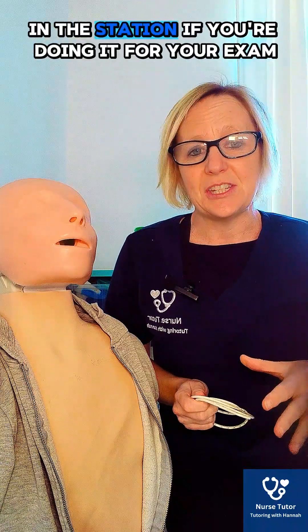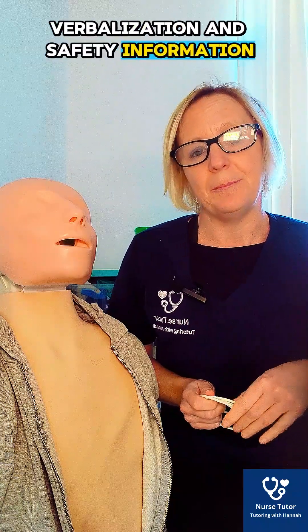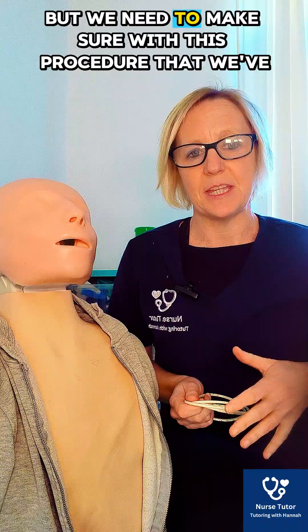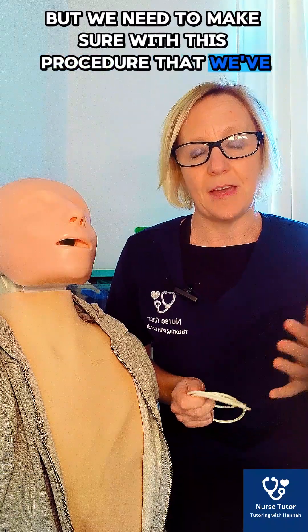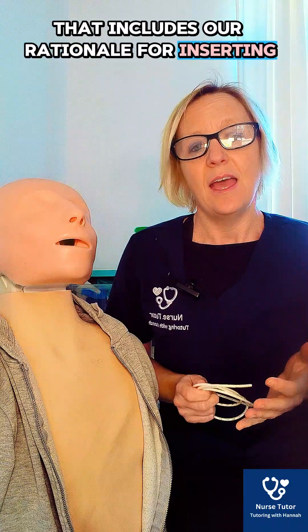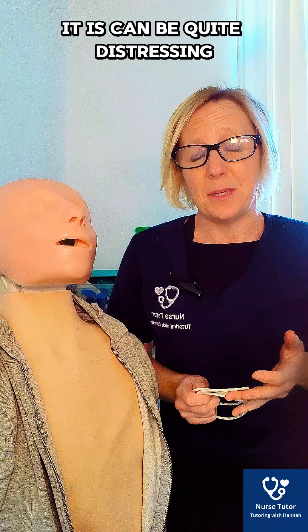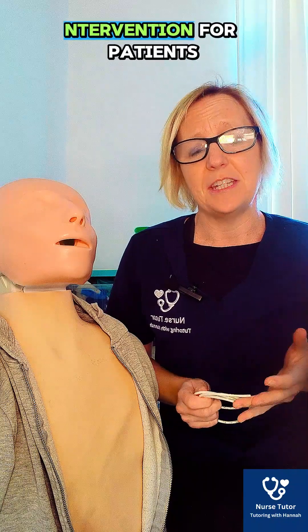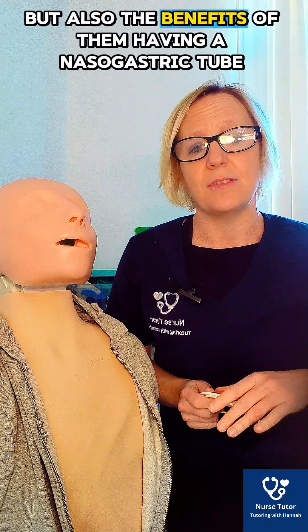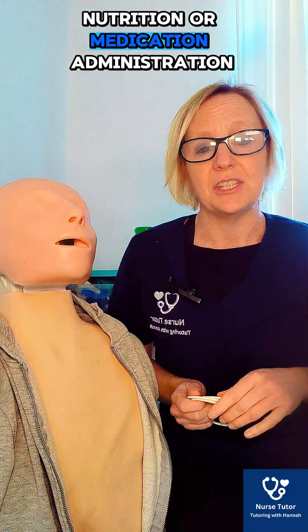There's a lot to do in the station if you're doing it for your exam, and there's a lot of key verbalisation and safety information. We need to make sure that we have fully explained the procedure to the patient to gain consent. That includes our rationale for inserting, and what the procedure actually involves. It can be quite a distressing intervention, but we also need to explain the benefits — whether for nutrition or medication administration.